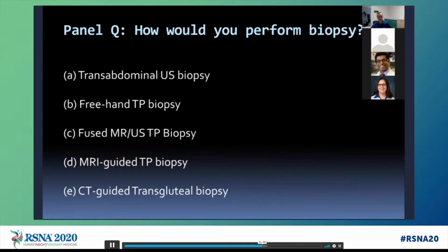The reason why I like doing a fused biopsy is it also gives me staging information with regards to the rest of the gland. So I'm still able to complete a 12-core biopsy to understand what is the volume of disease in the rest of the prostate, essentially being able to identify sites of MR invisible disease. These procedures, I do it with an end-fire ultrasound probe. It's essentially a transrectal probe, but using the end-fire component of it. And it's done under sedation with a catheter in place, which acts as a landmark for me to be able to visualize, because it can be disorienting having a different view, and the urethra basically helps normalize that.